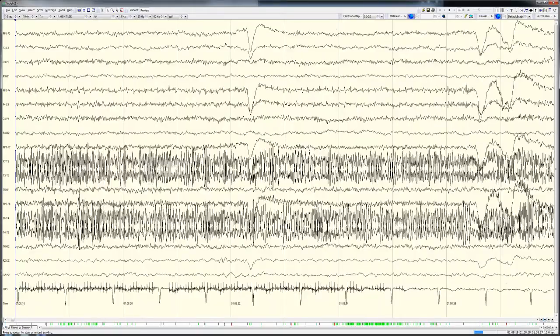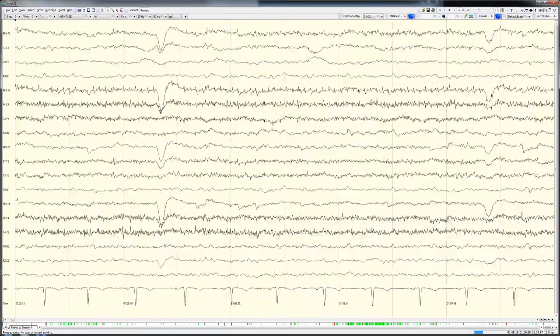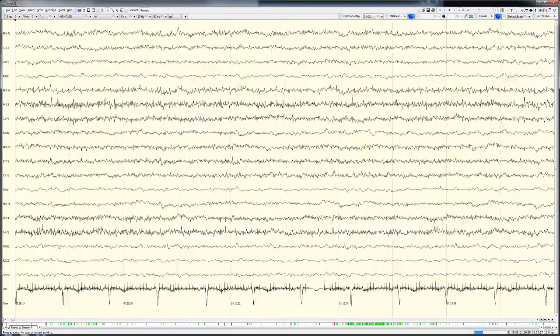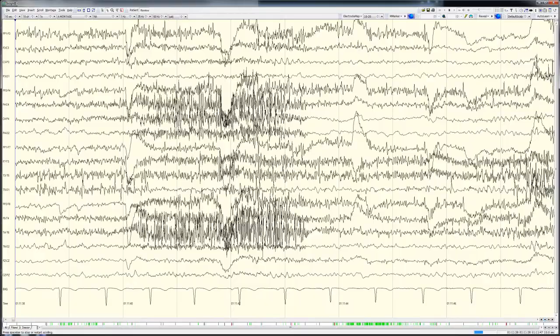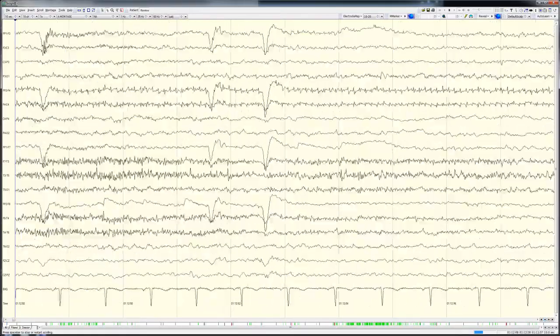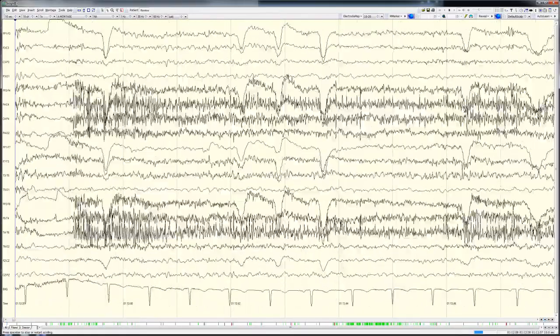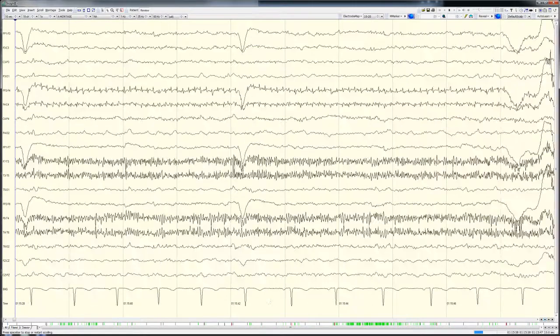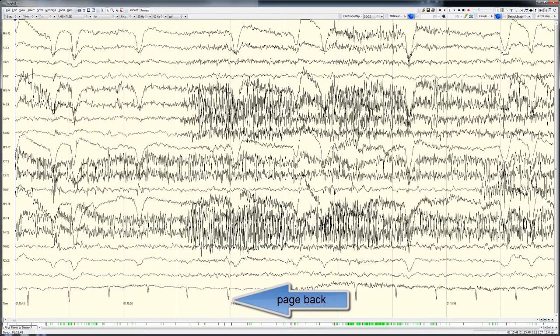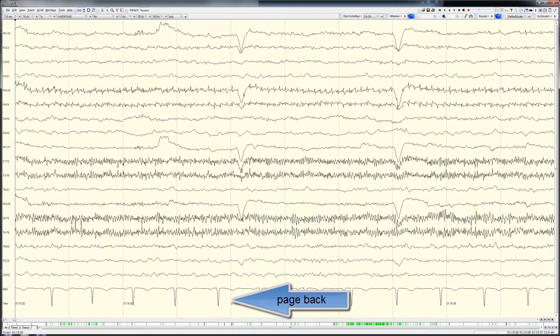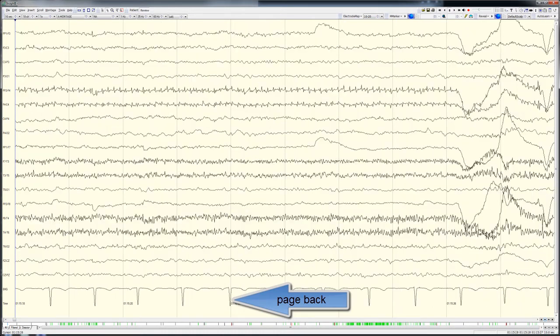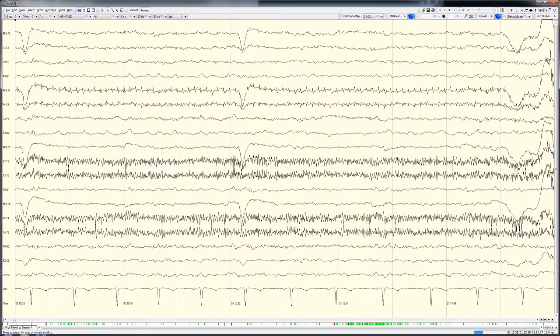Because such a review requires the reader's full concentration for an extended period of time, and because of the rapid paging involved in this process, monitoring teams recognize that some events will inevitably be missed. When a potential event of interest is seen during rapid EEG review, the reader pauses the recording, pages back, and reviews that segment of EEG more carefully.